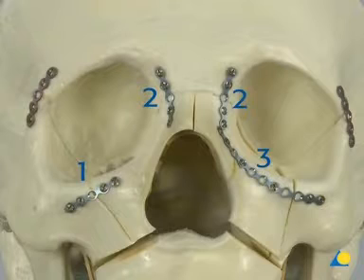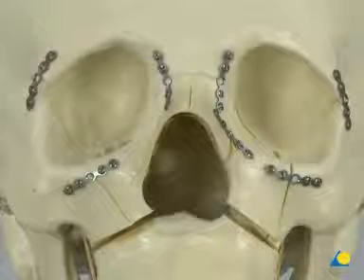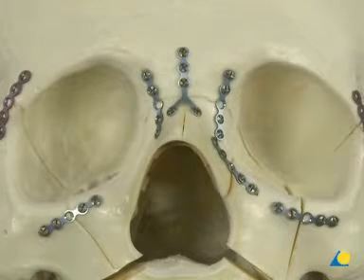The left orbital rim reconstruction can be achieved with either one long plate or a combination of smaller plates. In addition to, or instead of, the two small plates along the naso-frontal fracture, an inverted 0.5 mm thick Y plate can be used for further reduction and stability of this area.